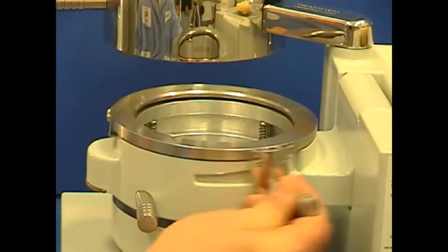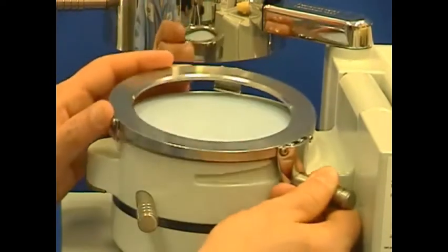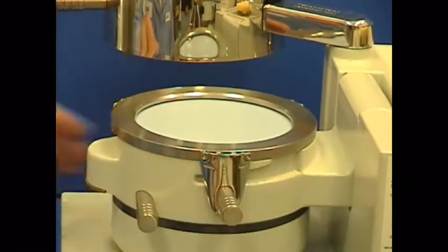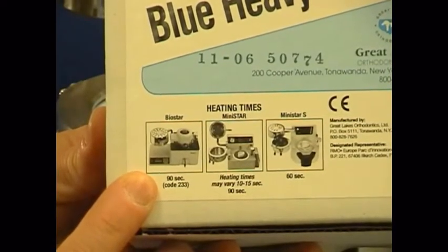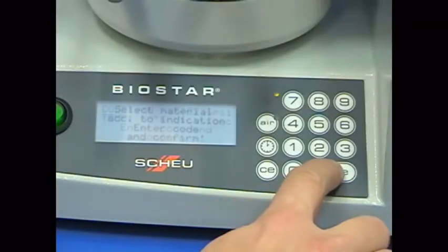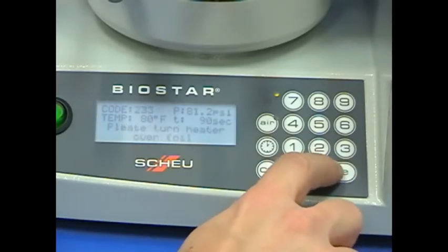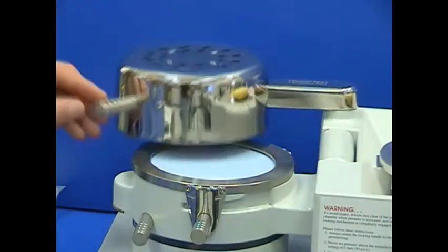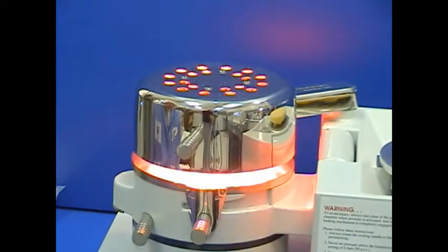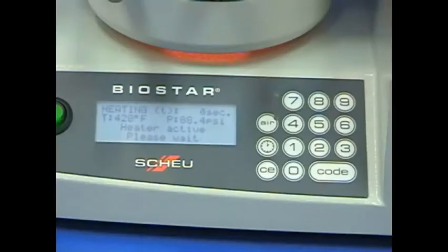Clamp the 3 mm blue heavyweight material onto the pressure chamber. Identify the material's heating time or BioStar code and enter it into the machine. Swing the lamp over the clamped material to start the heating cycle. At the end of the heating cycle, remove the lamp from the material.